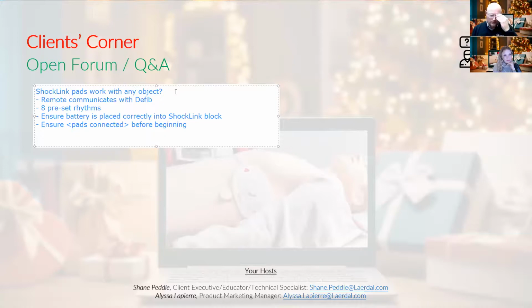It was really cool. We were actually experiencing that kids in grade 5 could, without any instruction, get a defibrillator onto a patient and shock a patient within 2 minutes. That's good to know for AED. That's without any instruction, just following pictures and doing some pretty cool stuff. One group actually did it in 46 seconds. Go them. Awesome.